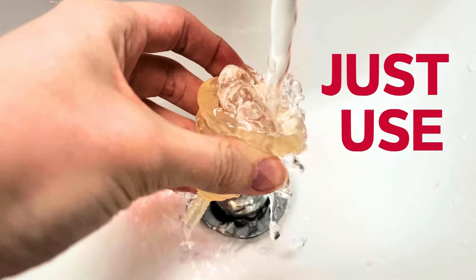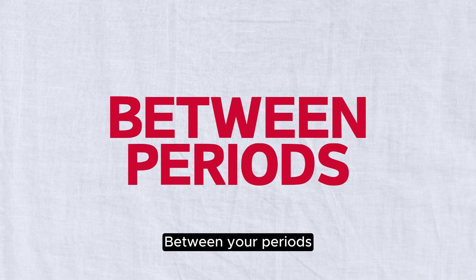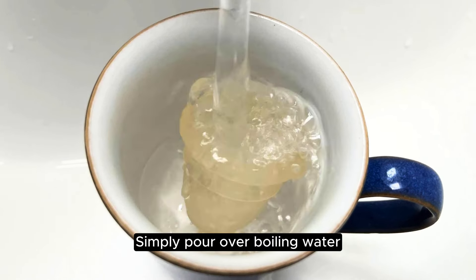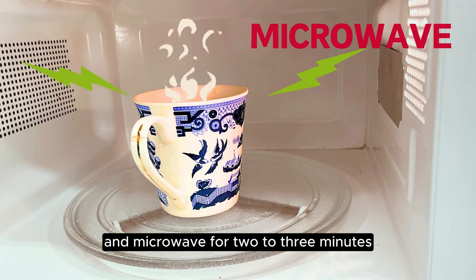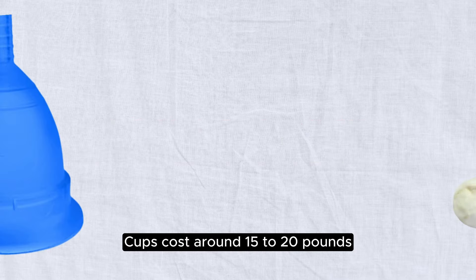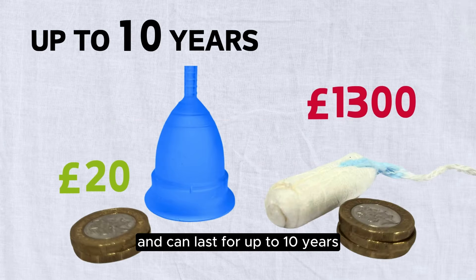Between your periods, sterilize your cup by simply pouring boiling water over it, microwaving for two to three minutes, or boiling it on the stove. Cups cost around £15 to £20 and can last for up to ten years.